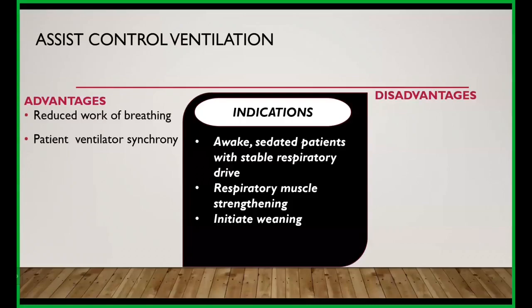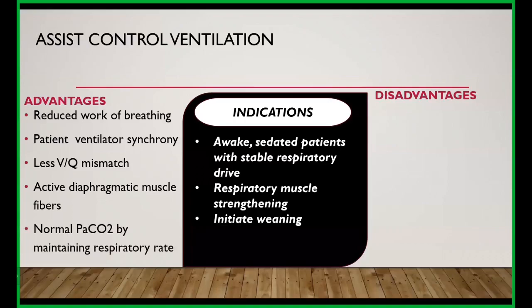Advantages: naturally, it is going to reduce your work of breathing. Patient ventilator synchrony is better compared to the controlled ventilation. Less ventilation perfusion mismatch. Diaphragmatic muscle fibers will be strengthened in this mode. Normal PaCO2 will be maintained by maintaining your respiratory rate.